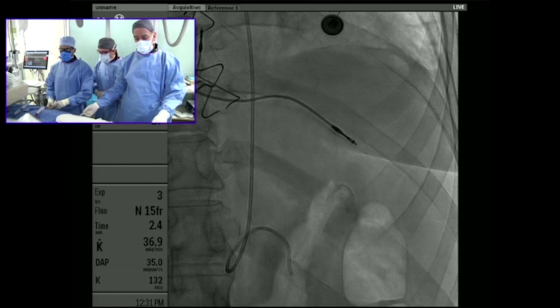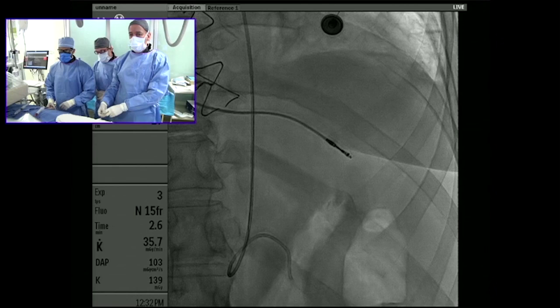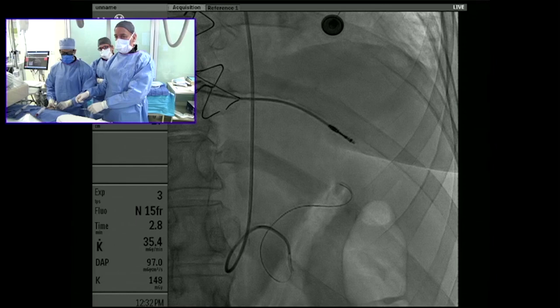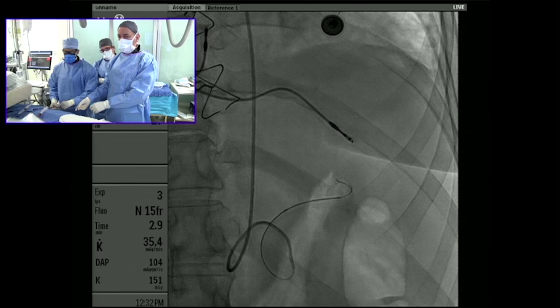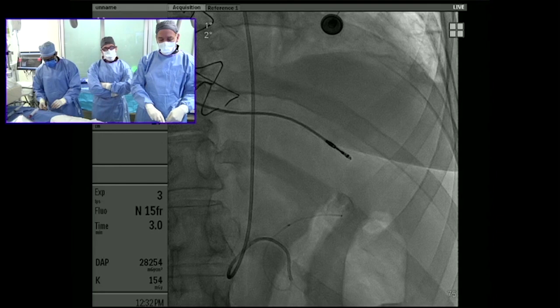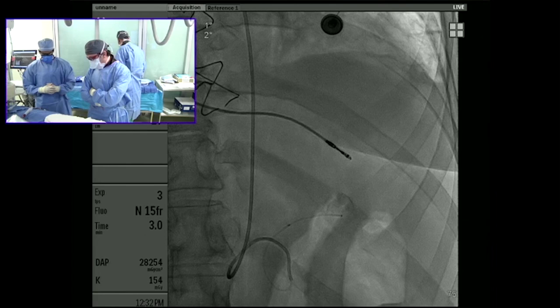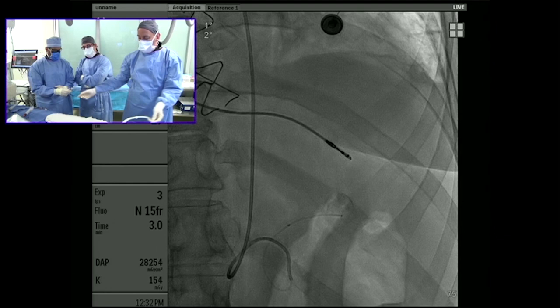We parked the seroradial in the celiac artery to perform a celiac angiogram, then used a Glidewire Advantage — which has a soft floppy tip but is very supportive on the back end. The seroradial does have a slight ledge, so there is a dissection risk. I gave a little nitroglycerin to prevent spasm. In this case the splenic artery is a nice size without many turns. We then advanced a 150-centimeter Terumo Progreat microcatheter, 2.8 French, with the tip now positioned inside the aneurysm.